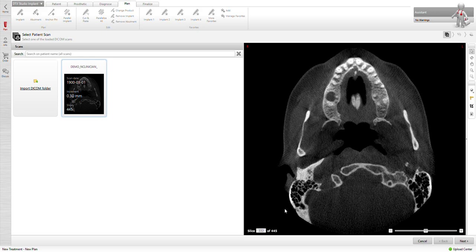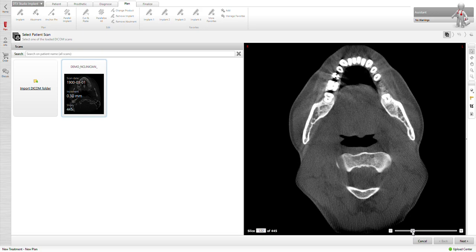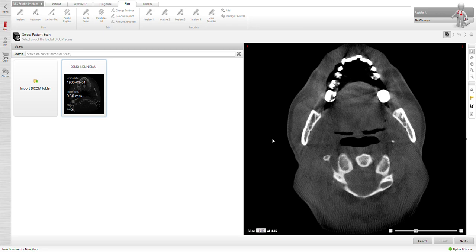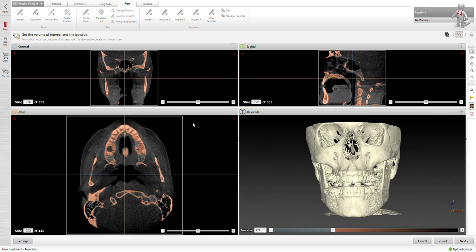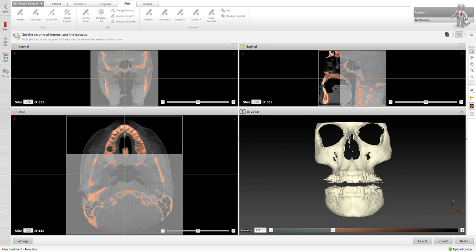We'll go ahead and it will import. Now we need to check to make sure we have the right patient and scan. Yep, missing number 19, that's the file I want. We hit next, convert. Now I need to go ahead and set volume and ISO value.